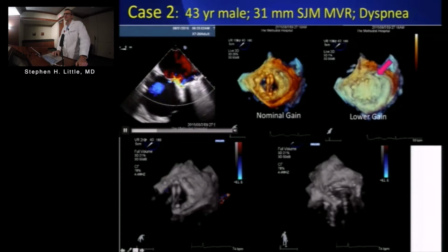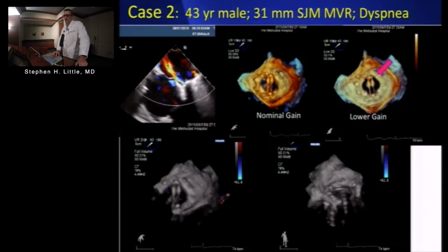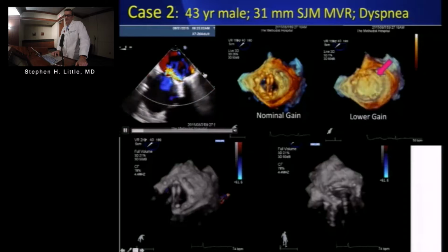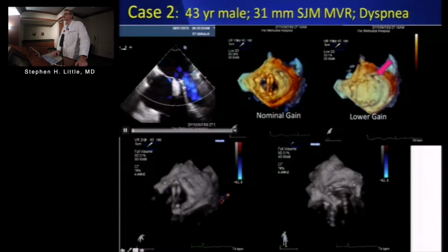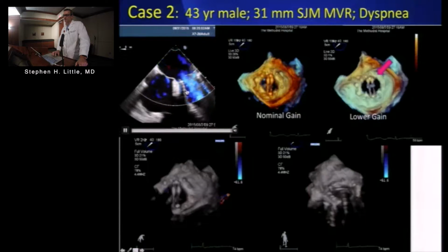So the far right side shows a normal, small one. One of the ways you know is that it's at the hinge point, and it's very short in dimension. If it were out lateral, the way this one was, or comes as far back in the atria as the way this one does, it would suggest a paravalvular defect. So this is a very medial paravalvular defect. It's scooting up along the atrial septum, so you know it's medial.